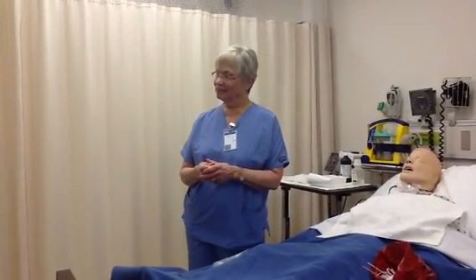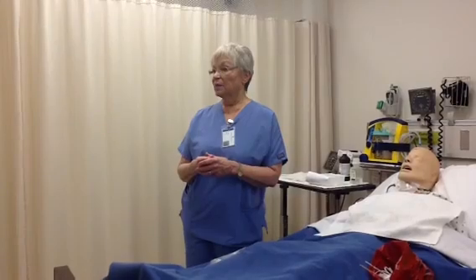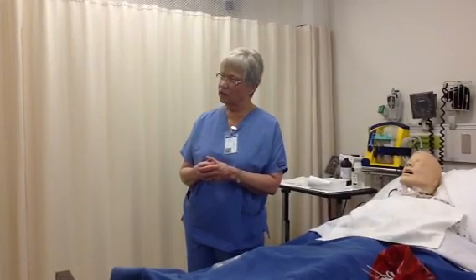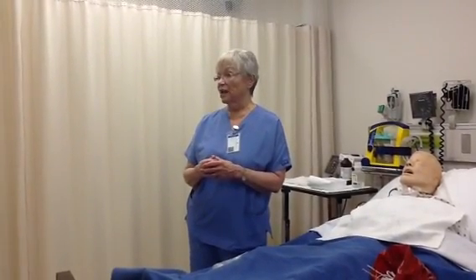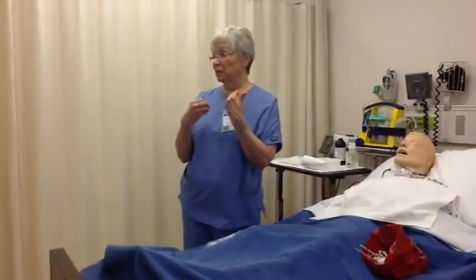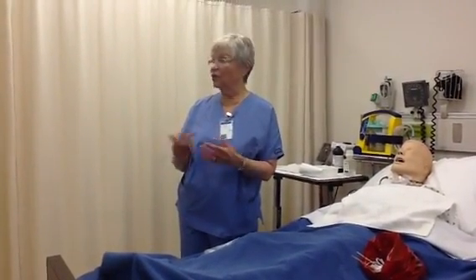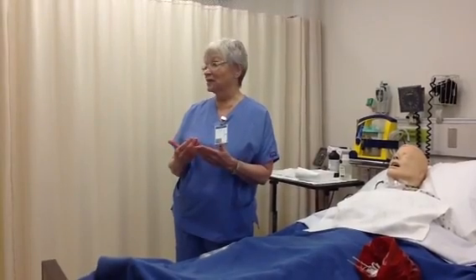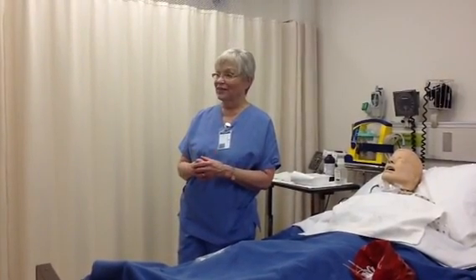Would you have them deep breathe after trach suctioning? Yes, we do have them deep breathe, because once again we have removed the oxygen along with it. Did you say after trach care or after suctioning? Or both? Yes, after trach care. Yes, after trach care also we would think about oxygenation because we have been in that airway cleaning and manipulating that inner cannula in and out. So we could have somebody deep breathe right after we have finished, or even during the procedure we could have them deep breathe and or replace their oxygen if we see any signs that they are struggling with breathing. And we do the same thing with the suctioning, so I appreciate your asking that question.